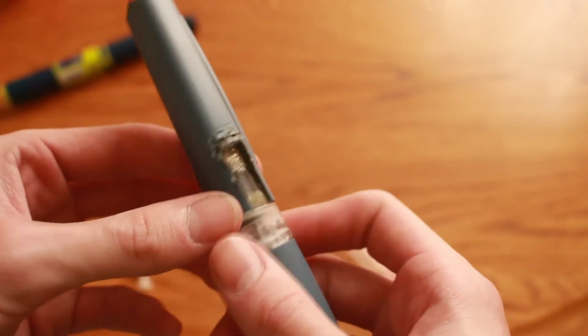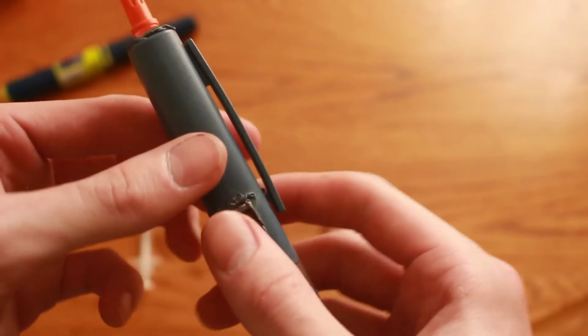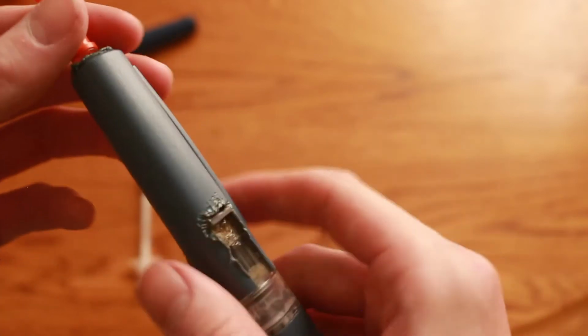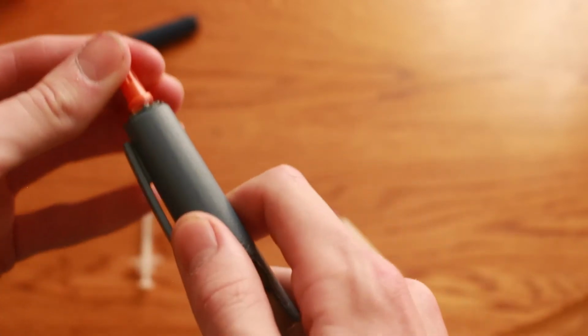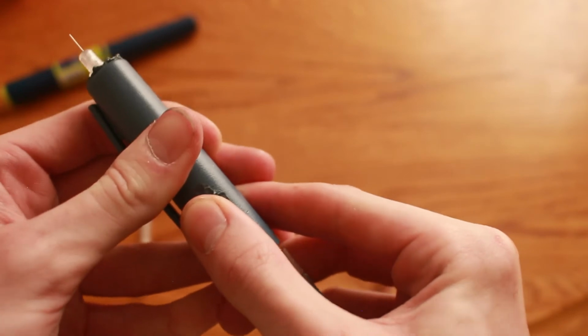I have this cap on it. You see that it's burnt through a little bit to make room for the edges of the plunger here. But the idea is the cap is on to keep it tight and to keep it from moving, because if it moves, then it's not going to be very accurate. Let me just show you what it looks like inside.